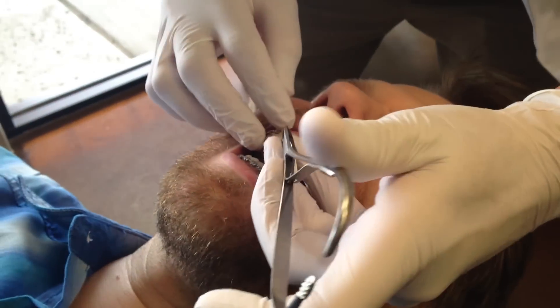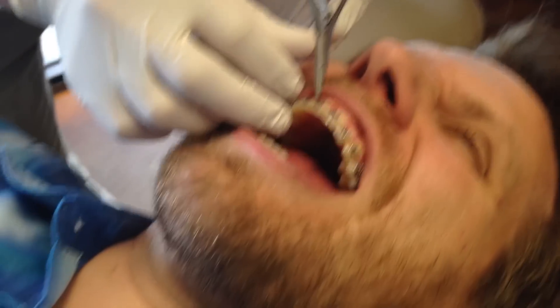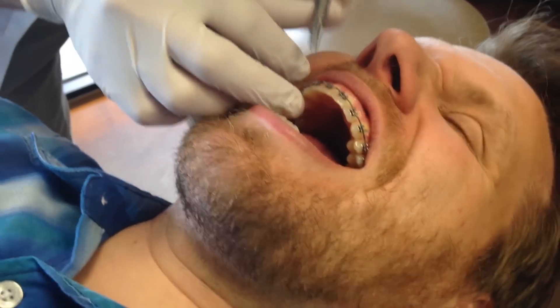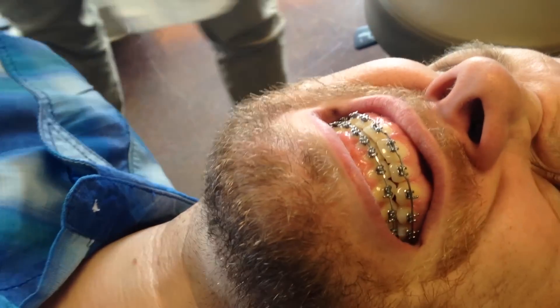I'm going to need... I can probably do it. He's wire tied in here, I just need a clipper. You need another birdie? No, I need a clipper. Pain center? Yes, ma'am. And a different birdie because this one is a canine. Don't worry.